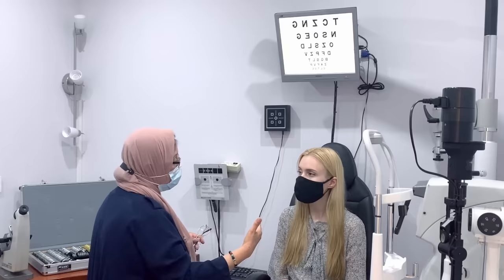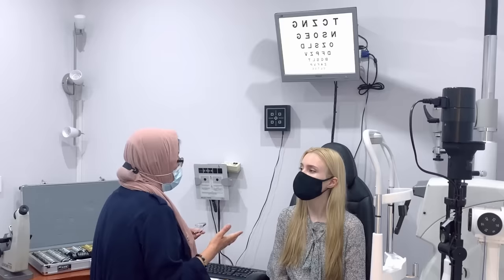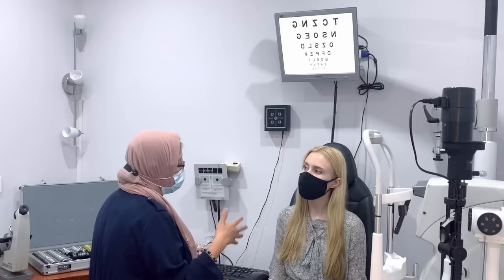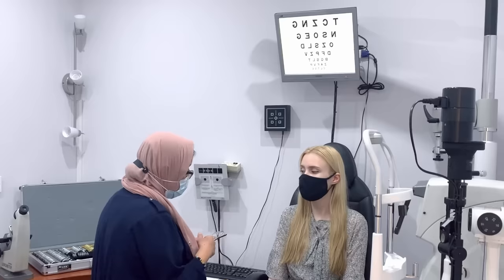Okay. So effectively, there's not a huge change. Yeah. You know? If you didn't want to change glasses, you don't have to. Okay. But I've seen a change and you appreciated that subtle change, okay? Yeah. And also with the digital, using it with the digital, it will also help. Okay. The other thing is you've got an anti-glare coating on there, which is good.